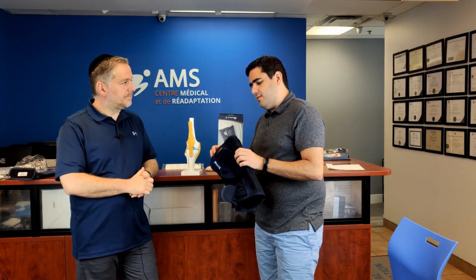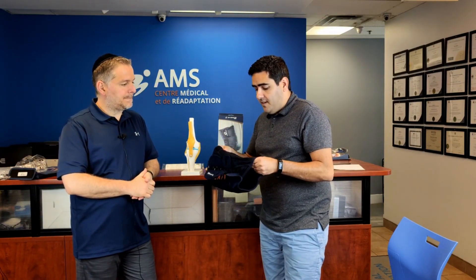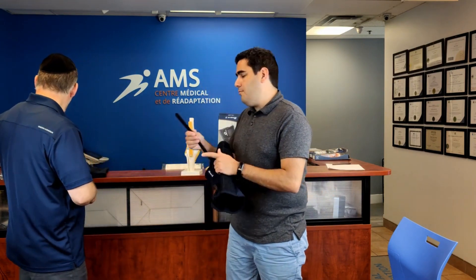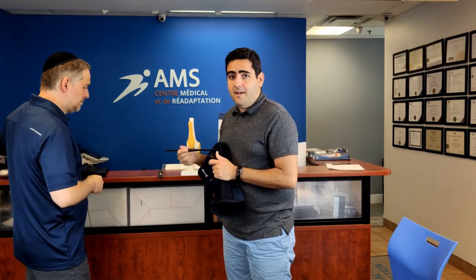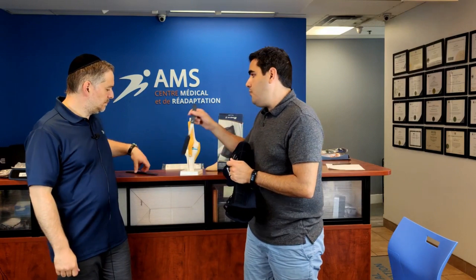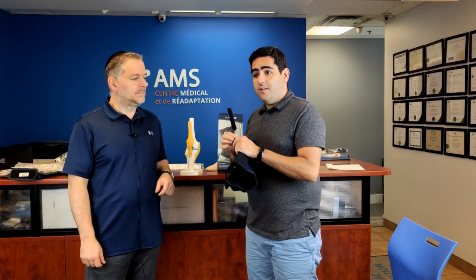One more nice feature of this brace, like a lot of M-Brace products, is that it's 2-for-1. If you need a lot of support, you have the full metal hinges that give really good support. But once your injury is improving and you just need minimal support, you have a spring one.